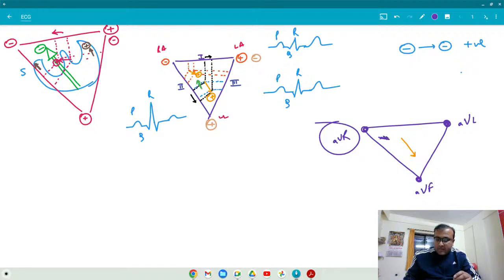So is the P wave, meaning the depolarization, moving away from you or towards you? Two people have answered away. Two are left. Okay, away. One is left.